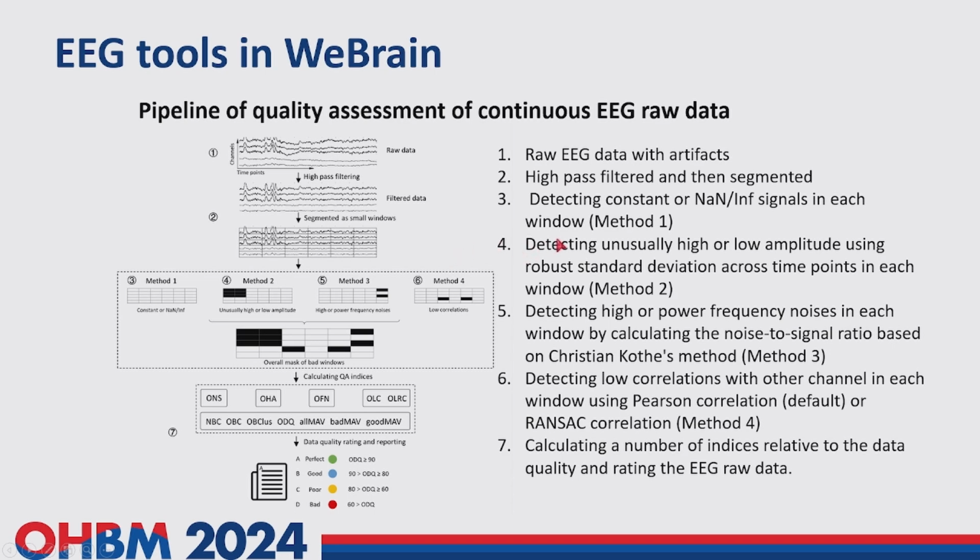After the above steps, a number of indices relative to the data quality are calculated, and the EEG raw data are rated.